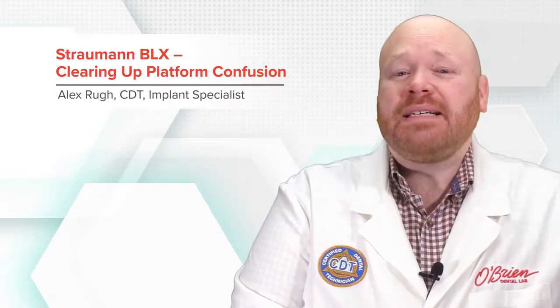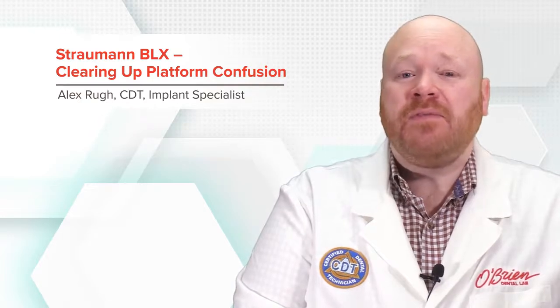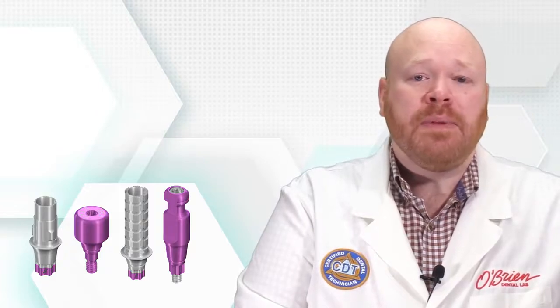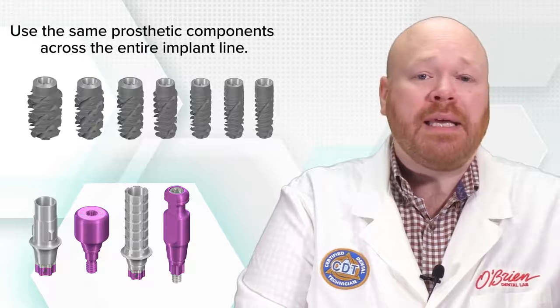The new Straumann BLX system has many great features, but there's one aspect of the system that has confused some of our customers, and in this video, I'm going to try and clear up some of that confusion. The Straumann BLX implants all share the same prosthetic connection regardless of the size of the implant, and this allows you to use the same prosthetic components across the entire implant line.